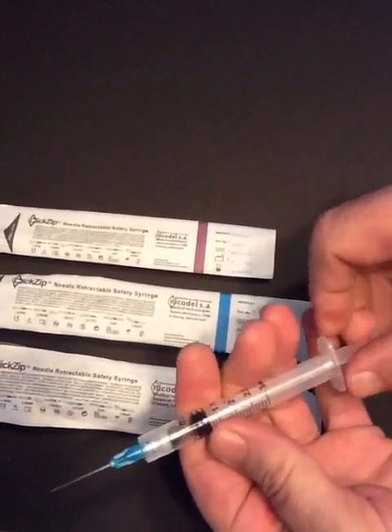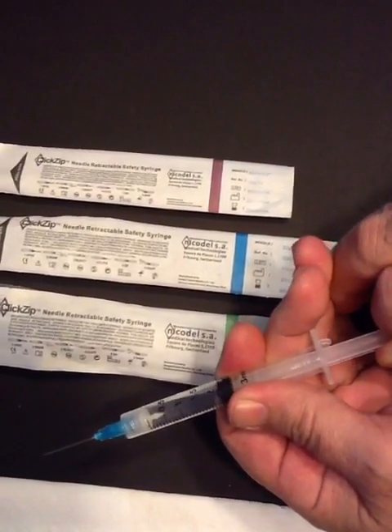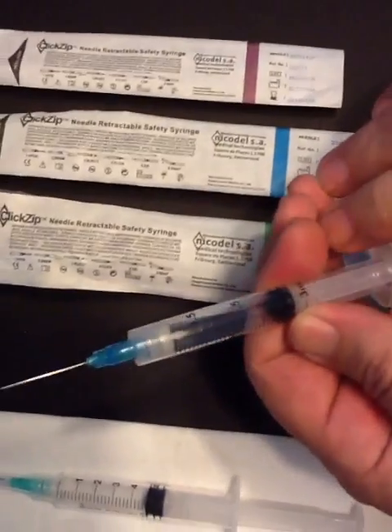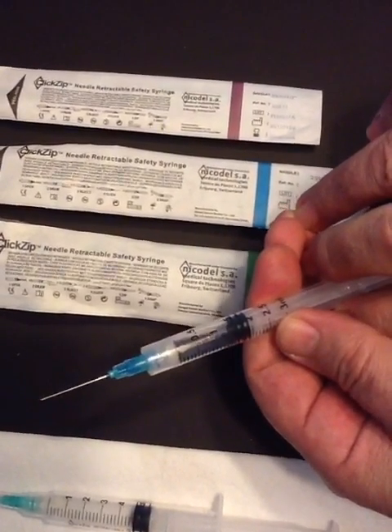Withdraw the medicine by using the same technique as the standard syringe. Expel the air by pushing the plunger. Do not push the plunger to the end.